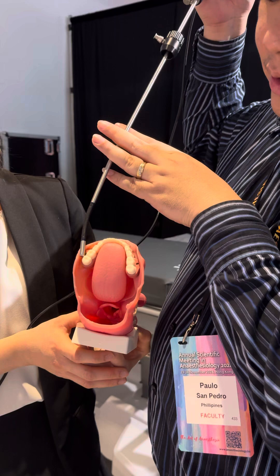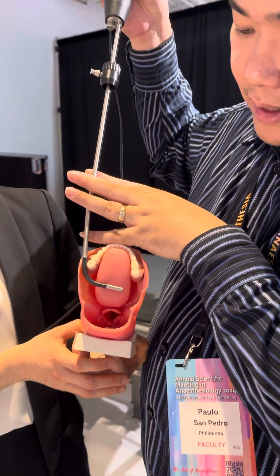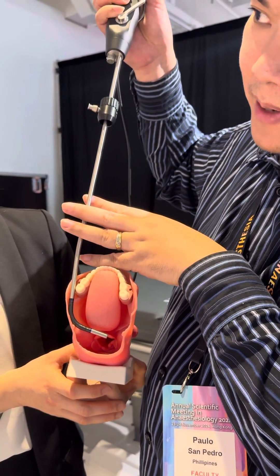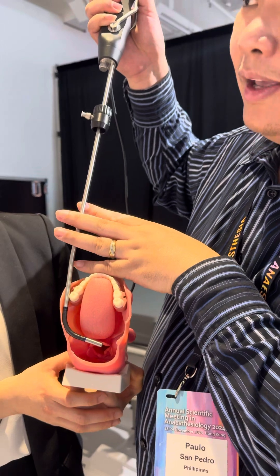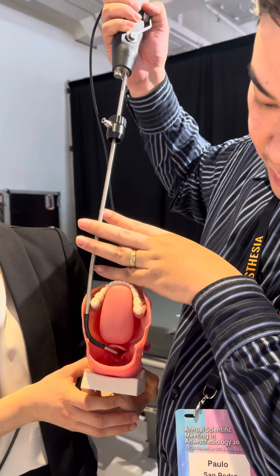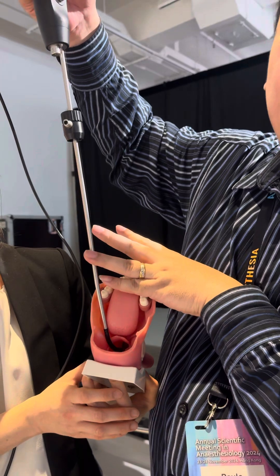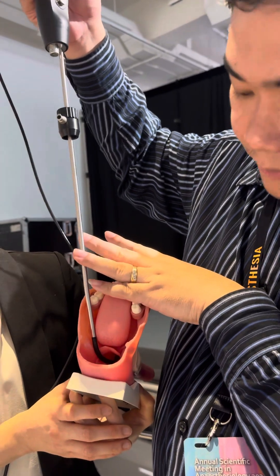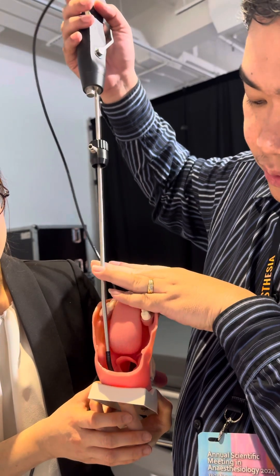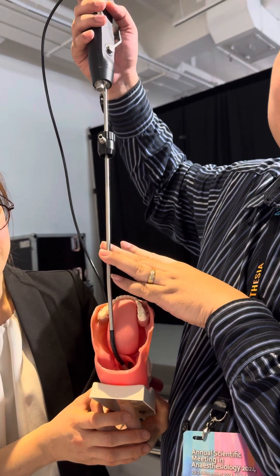So I enter here like this and then push down. When I'm here I'll see there's a block in the airway — note the blocked airway. From here you can twist. When you're here, just enter like that. If you fail — because usually the airway is collapsed — you could go into the esophagus, then slowly pull back, and then go in.